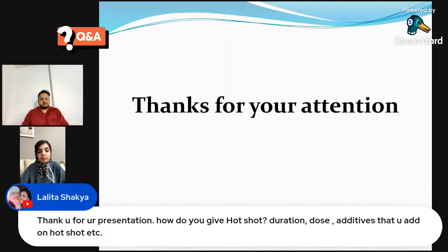Okay. So I would like to share my personal experience. Usually I add sodium bicarbonate, mannitol, and magnesium in the hot shot. The sodium bicarbonate acts as a buffer, and the mannitol acts as a scavenger, which removes all the residual potassium and toxins from the myocardium.